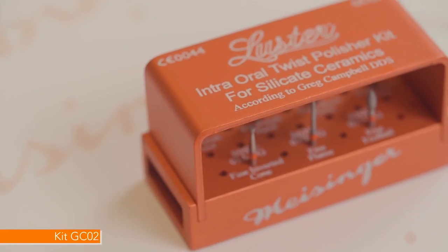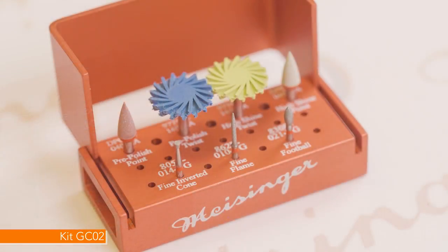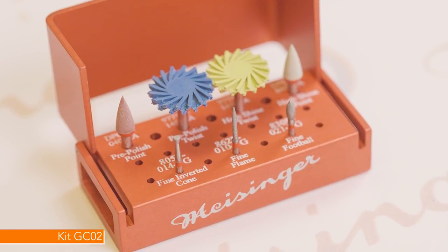I would like to add that there's also a GC02, which is an intraoral kit that you can use after you cement the restoration. You adjust your contacts and it will polish it back to the same luster.